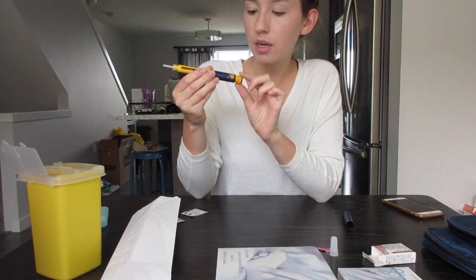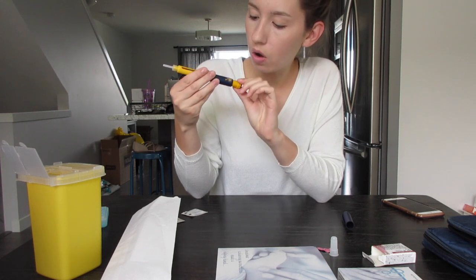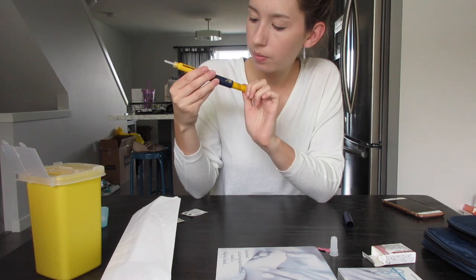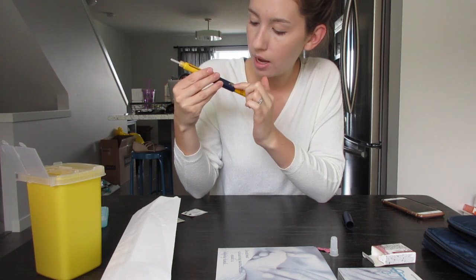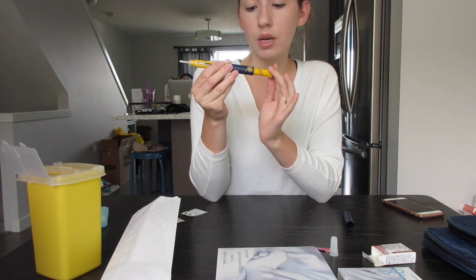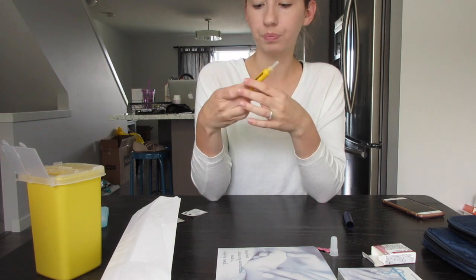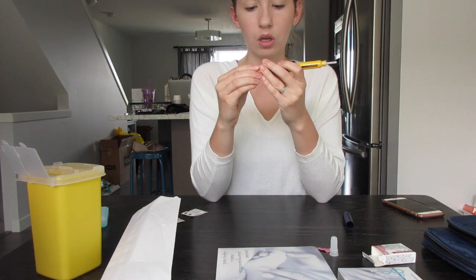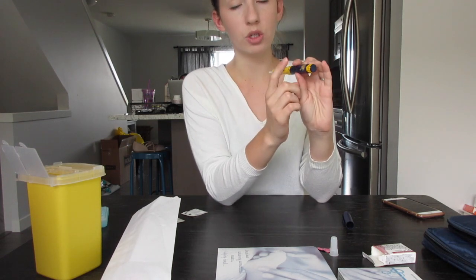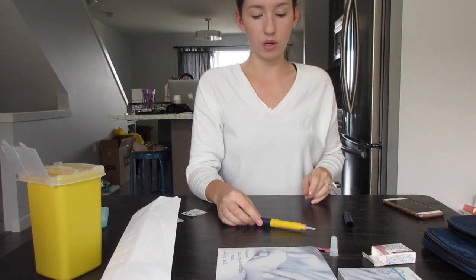The great thing about this pen is that if you go too far, oops, what you can do is just turn it all the way, all the way, until you get back to the end. There's this little arrow sign, which basically means you are now ready to push it back in, and then you can restart. So my dose today is 75. So you always make sure that you have the correct dose in the window, and then you're ready with that.